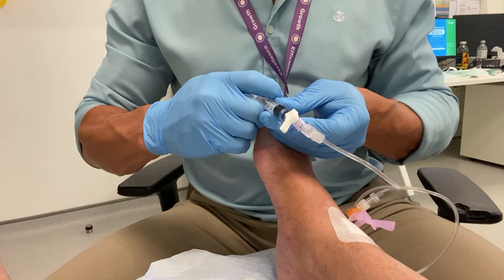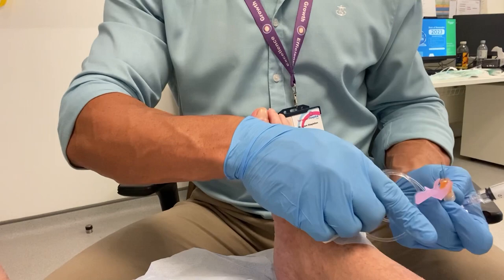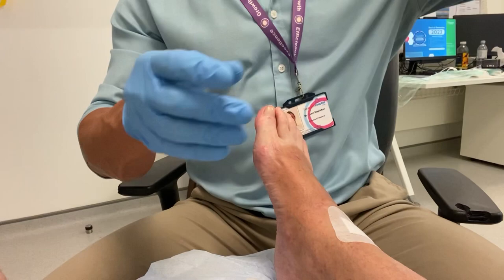Once that pressure gives, you know that all the hyaluronic acid is through the line. There can be some trouble with these safety needles — sometimes they're not easy to clip on, and about a third of them break off.